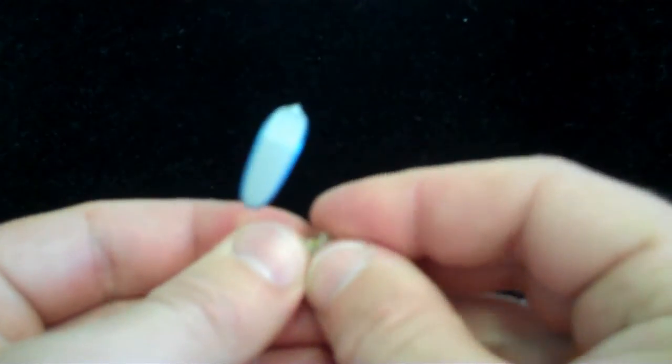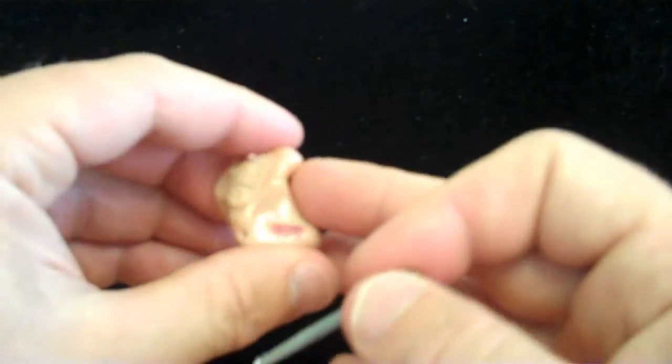The dome itself, just like the other product, we can scoop it out with the wire loop, poke a toothpick through it, whatever you like, and it just slides right back on the tip, right back on the end here. Now the same procedure is used with custom hearing aids that have a wax trap. Not all of them do, but if they do, that same white basket sits right in front of the receiver.